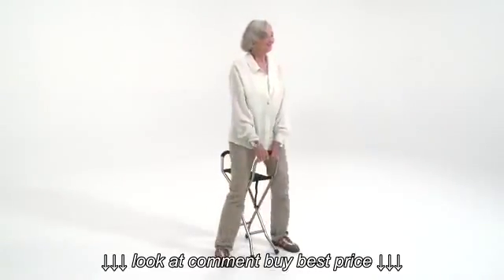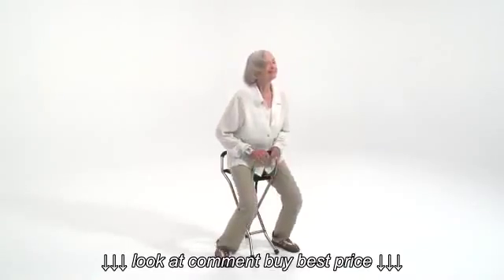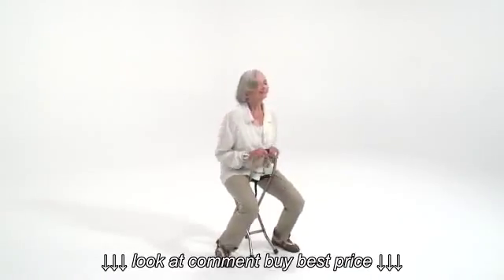The proper way to sit on the seat is to grip the handle, position it between your legs, and ease down onto the seat. To ensure safety, the back handle should not be used for back support.